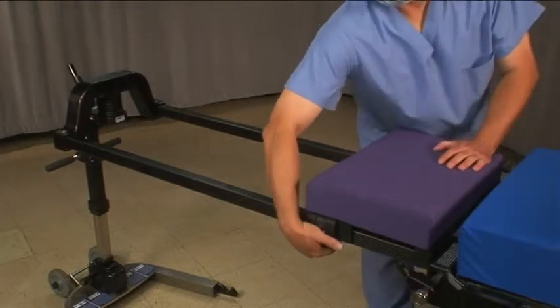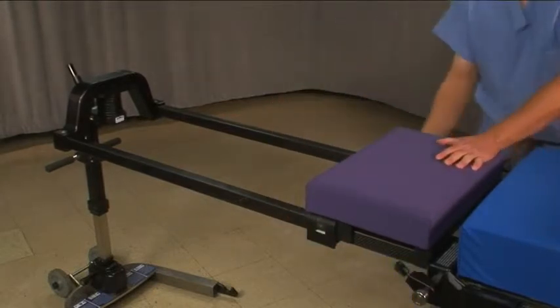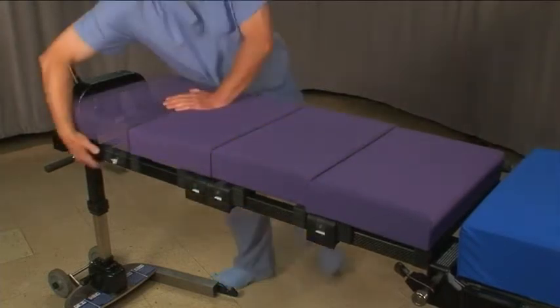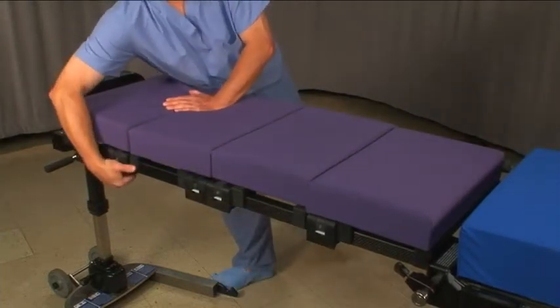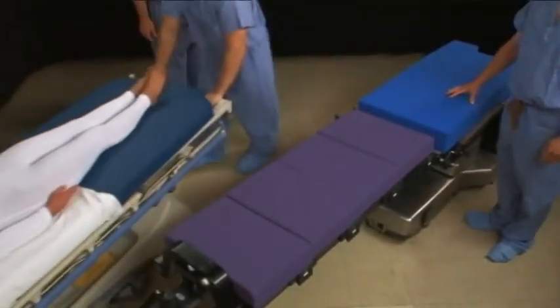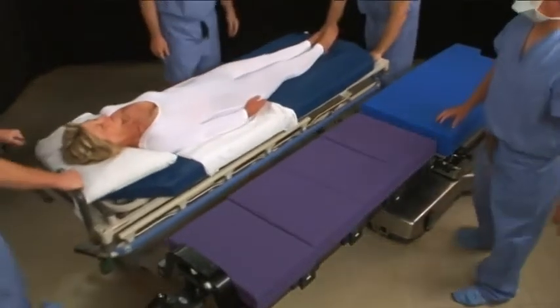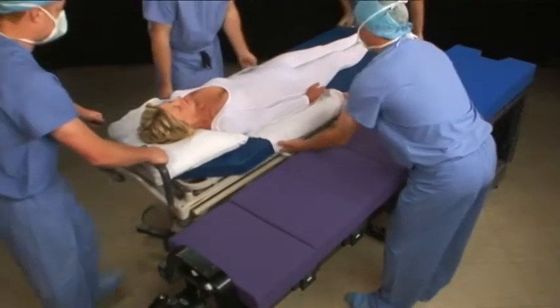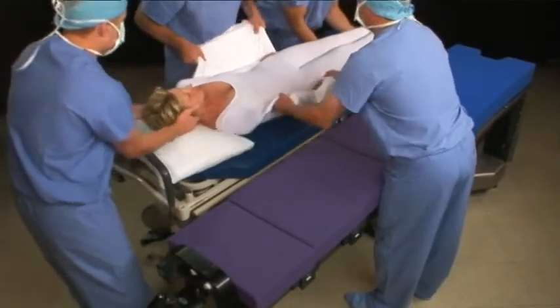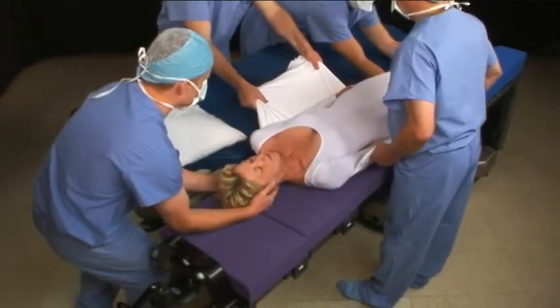The recommended products for supine procedures include 4 supine tops to cover the length of the frame. Arm boards can be used if desired. Adjust the frame and stretcher heights as we did for prone positioning. Bring the stretcher flush against the frame. Lock the stretcher. A sheet draw can be used to transfer a supine patient from the stretcher to the frame.